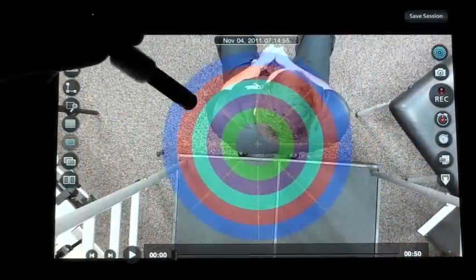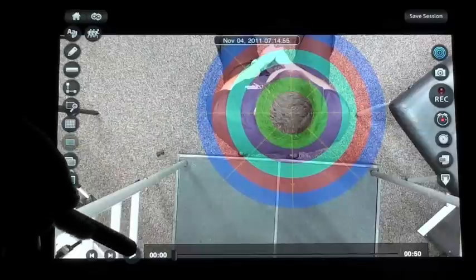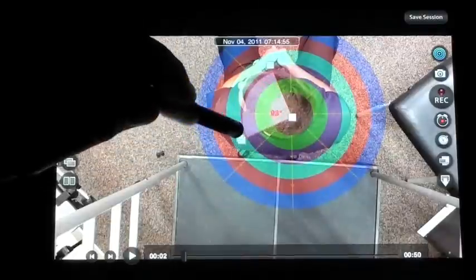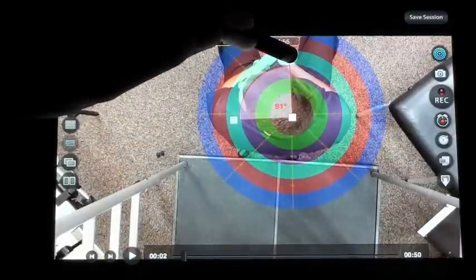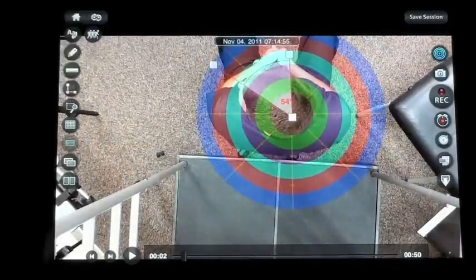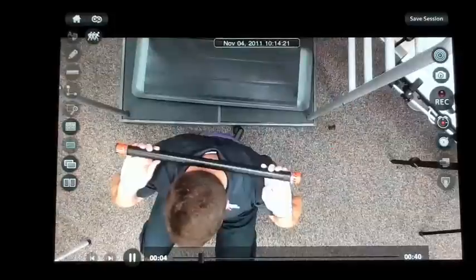The real power of Kinesia Capture is the evaluative tools. The bullseye grid is where it shines — you can use the 90-degree marks and the 45-degree marks as points of reference and find the axis, the point where the body is moving around. Use the goniometer and measure angles, use the nose as a point of reference, whatever you would like. Please share with us your creative ideas on how to use these tools with Kinesia Capture from this perspective.